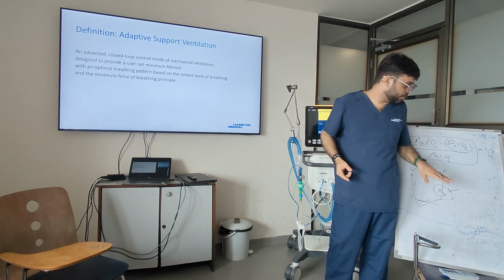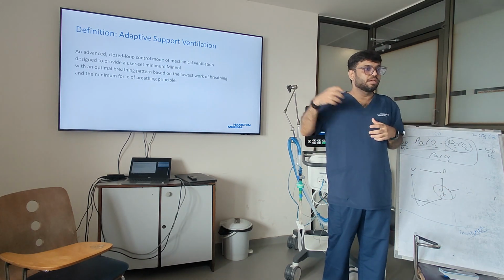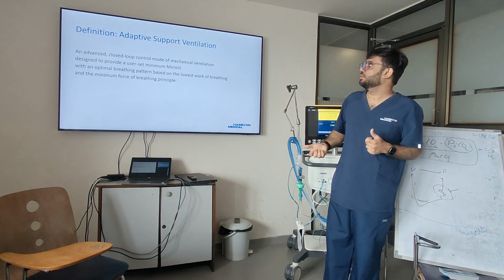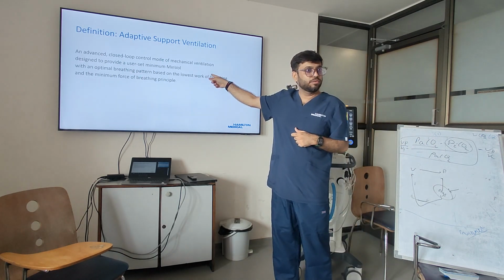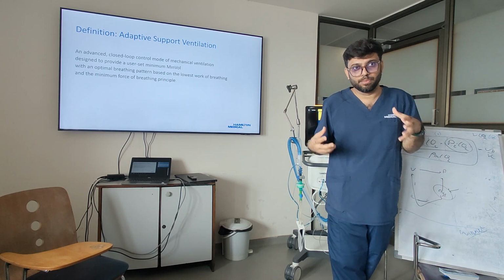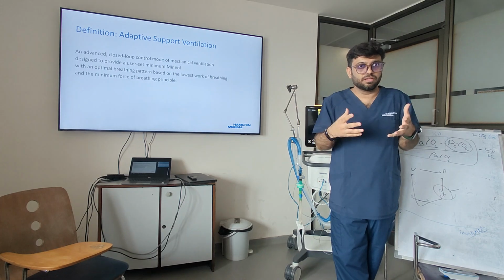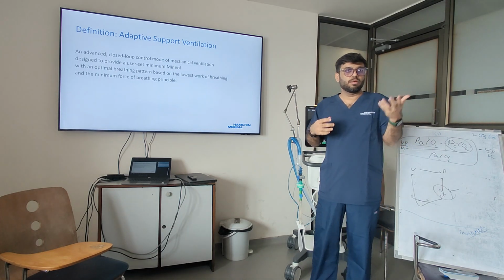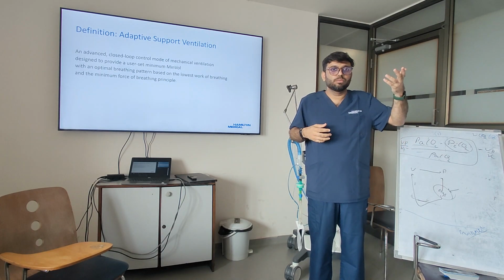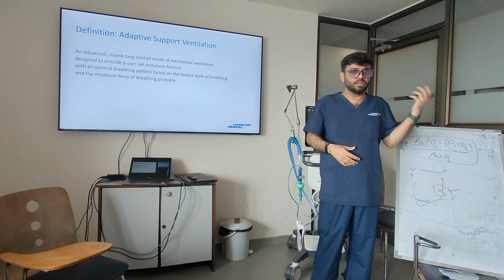With IntelliVent I am not saying we don't need the physician. We still need that, because there are still some controls in IntelliVent which remain in the physician's hands. I hope you understood. So you just have to set a user-defined minute volume percentage, as per the basal requirement of that patient to start with. Or, if you think the patient requires more minute volume, you can set the minute volume target as per your patient's requirement.